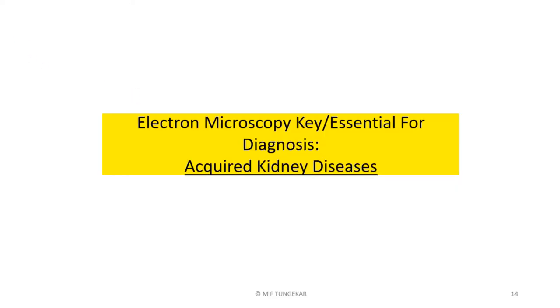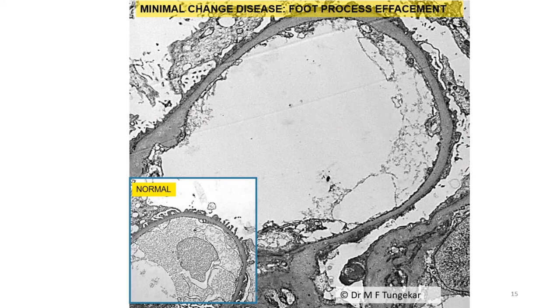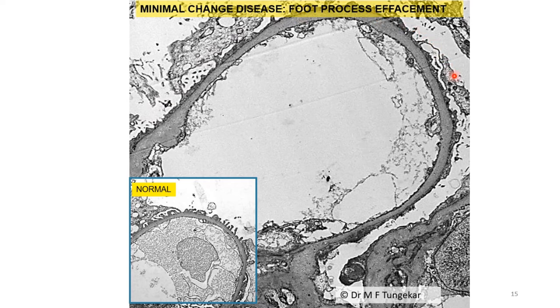In many acquired kidney diseases, EM may be a key or essential investigation. As the first example of an acquired disease where EM is essential for diagnosis, I will start with minimal change disease. In this condition, light microscopy and immunofluorescence microscopy of the kidney biopsy may show no lesion — that's why the name is minimal change disease, or normal light microscopy. EM provides the only clue to the diagnosis by showing diffuse effacement of foot processes of podocytes. Here is a normal capillary loop showing distinct, preserved foot processes, which are not seen in the affected case because they are effaced. Without EM, diagnosis is not possible. Minimal change disease may be superimposed on other renal diseases, as we shall see.